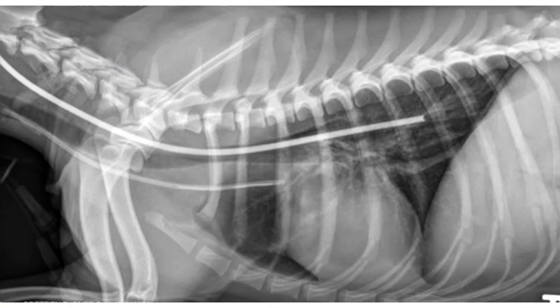To make sure you got it where it needs to be, a lateral radiograph can be taken. Most silicone esophagostomy tubes are radiopaque, so it will be seen in an X-ray. Count the ribs, and your tube must be in between the 7th and 8th ribs or intercostal spaces.